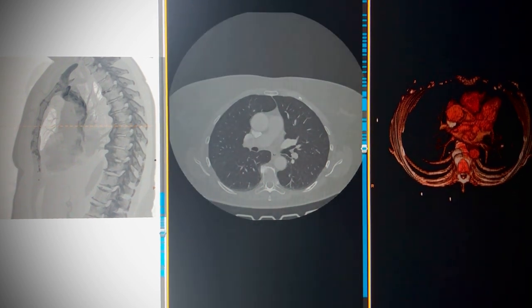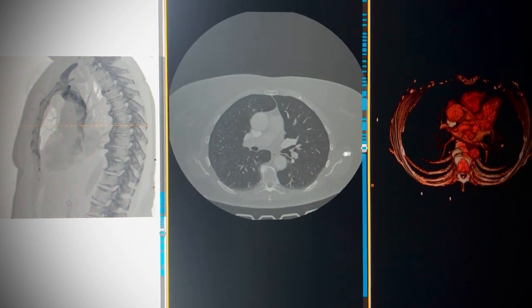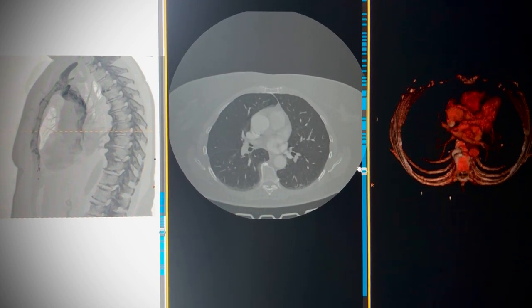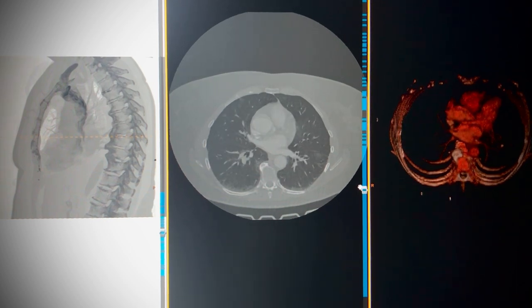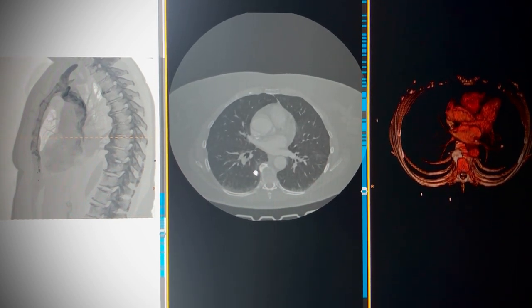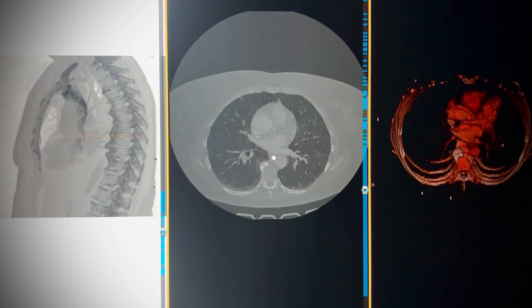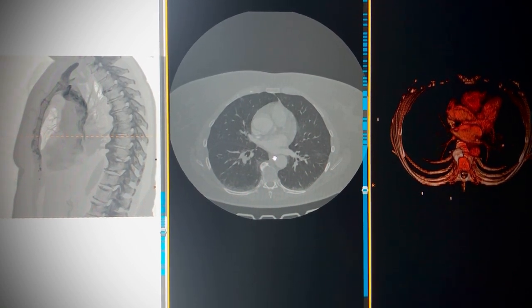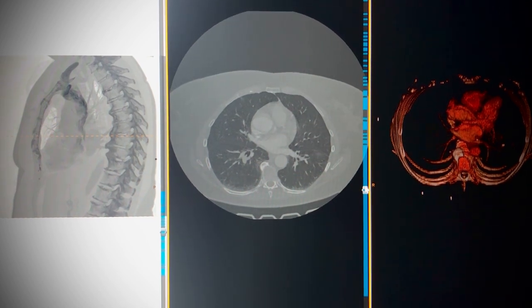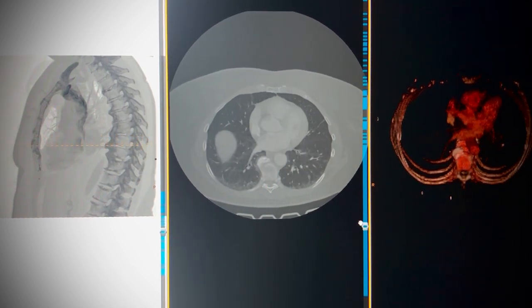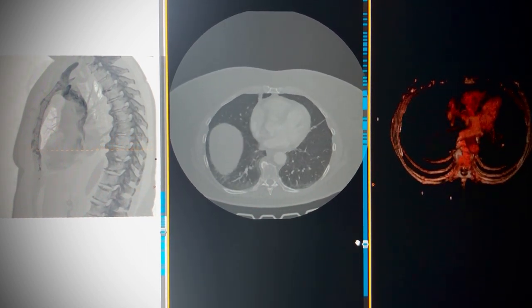If you look carefully at the adjacent lung, there are coronary areas of atelectasis affecting the adjacent lung in many individuals. This phenomenon is termed osteophyte-induced adjacent pulmonary atelectasis and fibrosis, and it represents varying degrees of atelectasis and fibrosis depending on individuals.